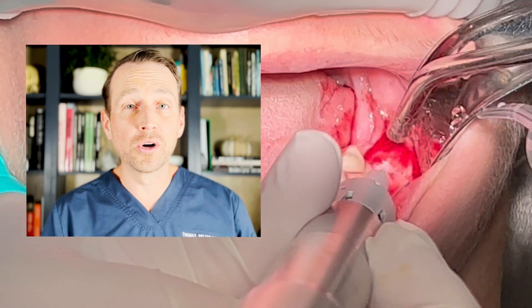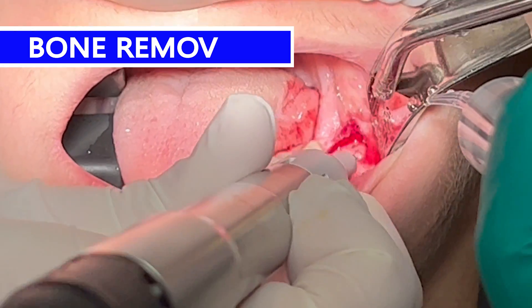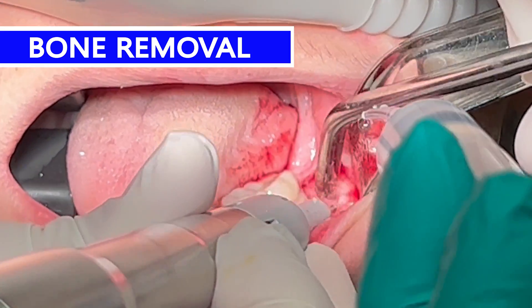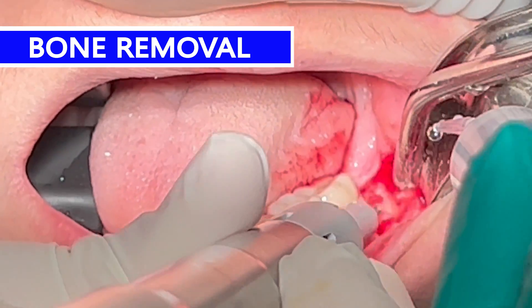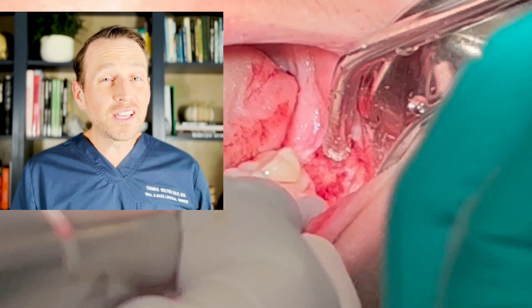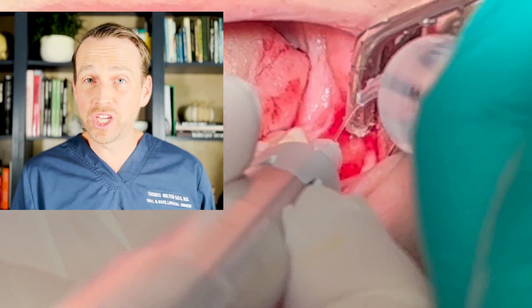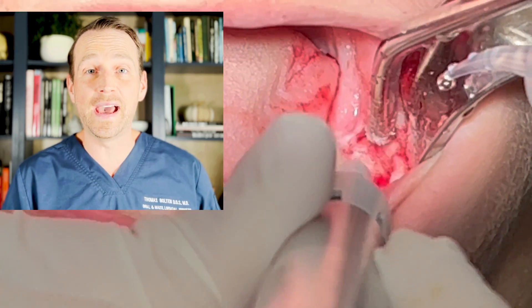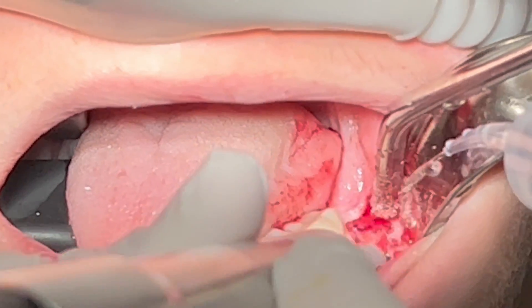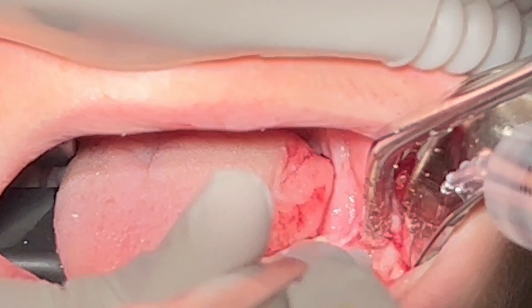Next, I use a round bur to uncover this lesion. I'm taking it slow because it might be hard to differentiate between healthy bone and this mass. I can see it coming into view, and now that I know what the consistency looks like, I can remove additional overlying bone.